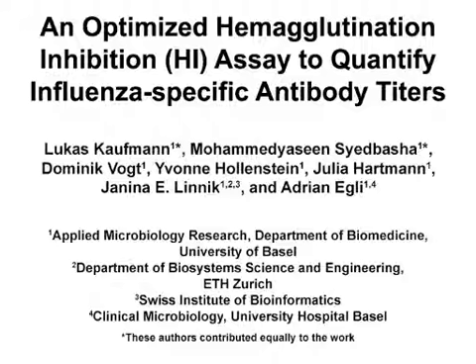The overall goal of this hemagglutination inhibition assay is to measure the antibody titers against specific viruses of interest. This method can help answer key questions in the vaccinology field about vaccine-mediated immunity and protection within different populations and across various age and patient groups.